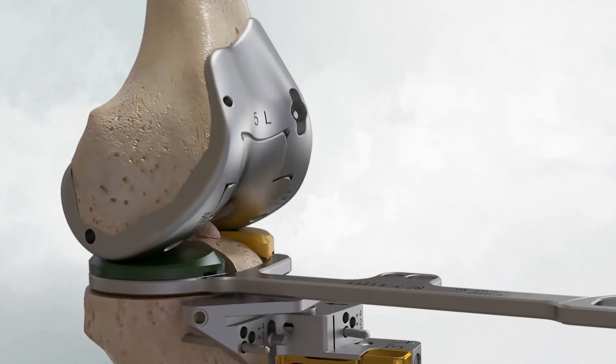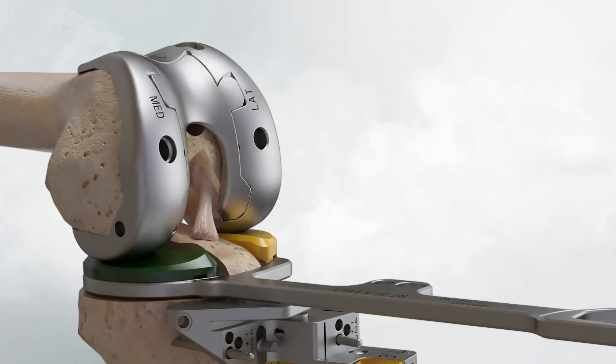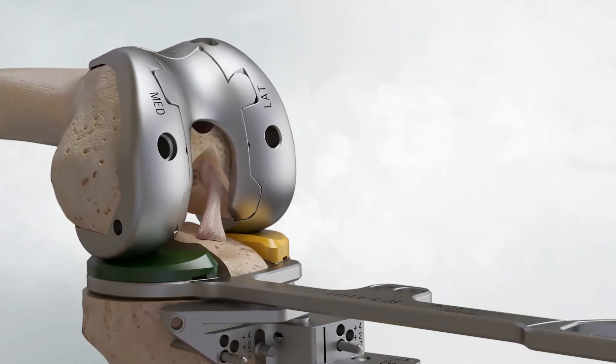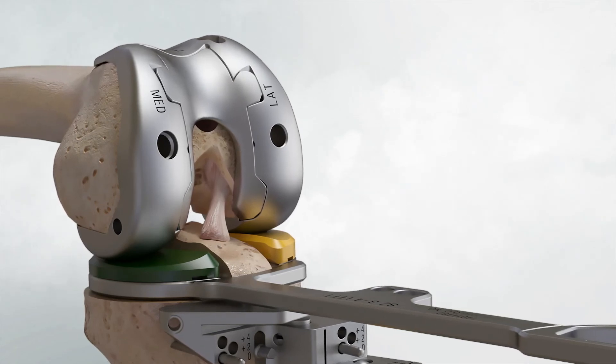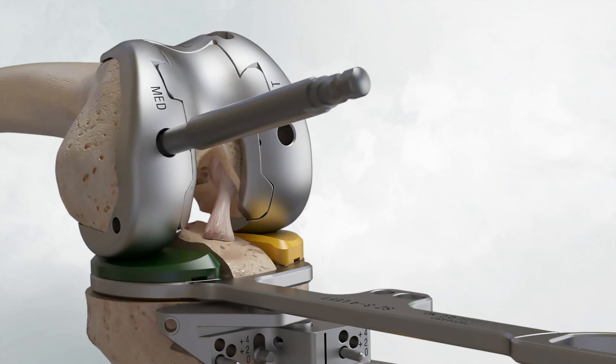Perform final trialing with patella and notch trial. If contact between femoral implant and cruciate ligaments is observed, consider adjusting medial-lateral position of the femoral trial and repeating the femoral intercondylar notch preparation.